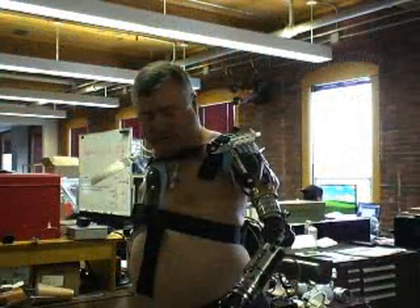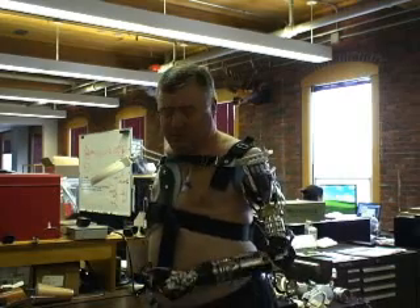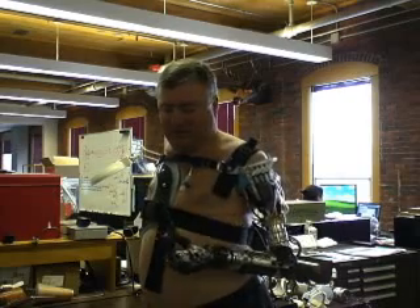Hildreth says he can't wait to get one of these in a real home environment. His wife feels the same way — she's already got a list of things for him to do.